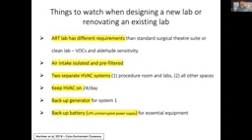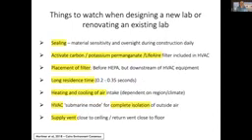There should probably be 2 separate HVAC systems, one for the procedure rooms and laboratories, and one for everything else. It's important to keep the HVAC on 24 hours a day and to have a backup generator for the first HVAC system that is controlling the sensitive area. There should be a backup battery as well, and probably UPS systems for different pieces of equipment. Also things to watch are listed here, such as sealing, material sensitivity, and oversight during construction.